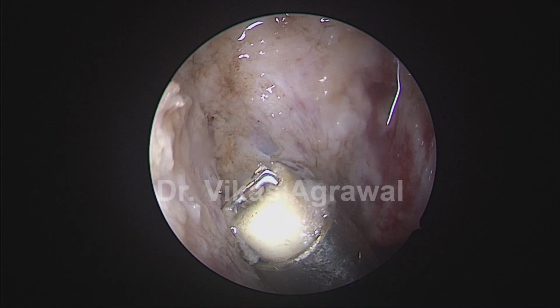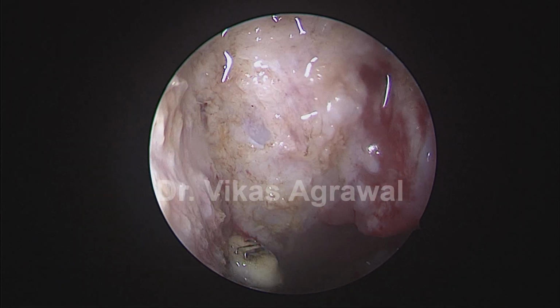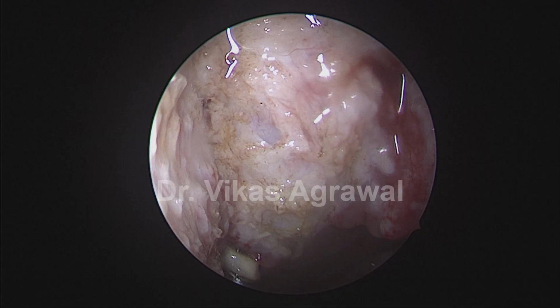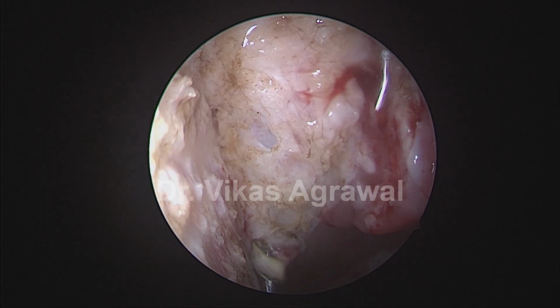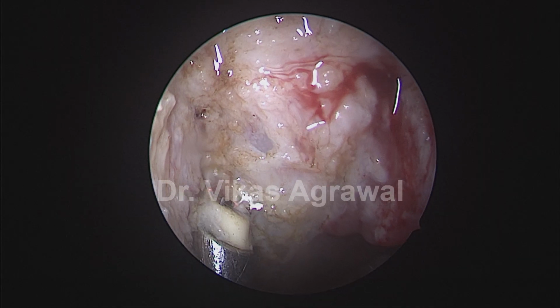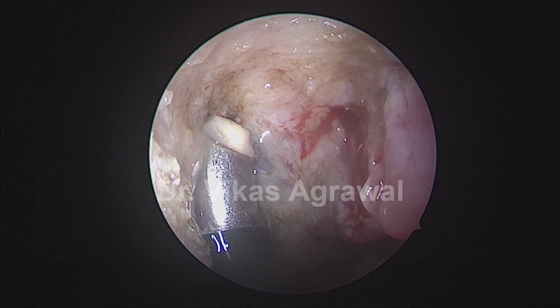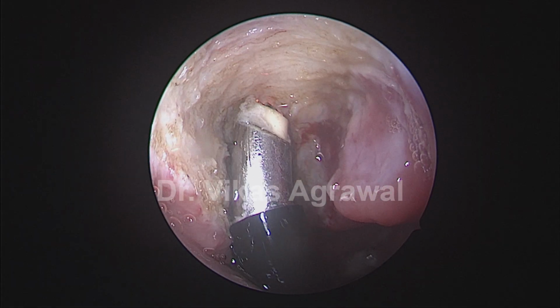And you can see my wand, the first wire is completely gone, the second one has become thin. And therefore it's not working so well. So I'll require to change the wand to go on to the left side, and therefore the hemostasis is not so good. But anyway, the right side work is over.